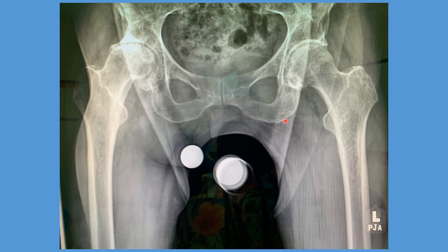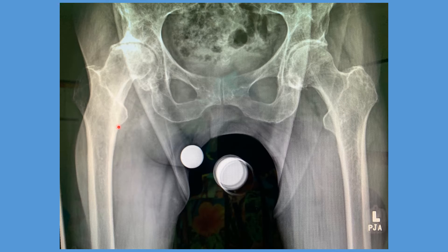After a few more attempts, we can see we now have a level pelvis with symmetry on the right half and the left half. We can also see the femur on both sides in a neutral position with the same rotation. This is a very good starting point, and from this we can get an accurate assessment of our baseline disease and understand what we need to do to correct the deformity.